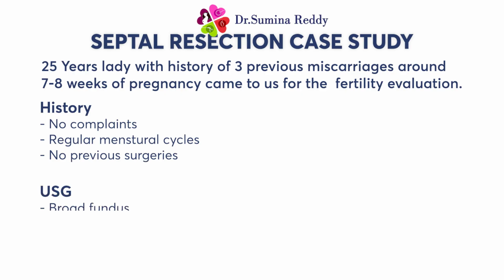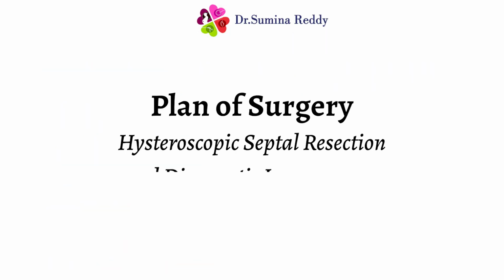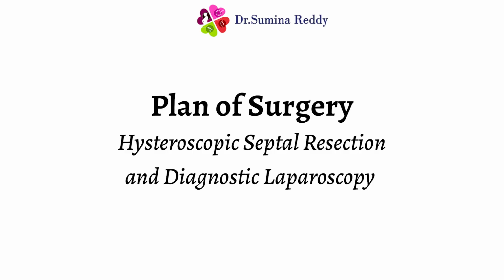Ultrasound shows a broad fundus and 3D transvaginal ultrasonography shows a subseptate uterus. Plan of surgery is hysteroscopic septal resection and diagnostic laparoscopy.